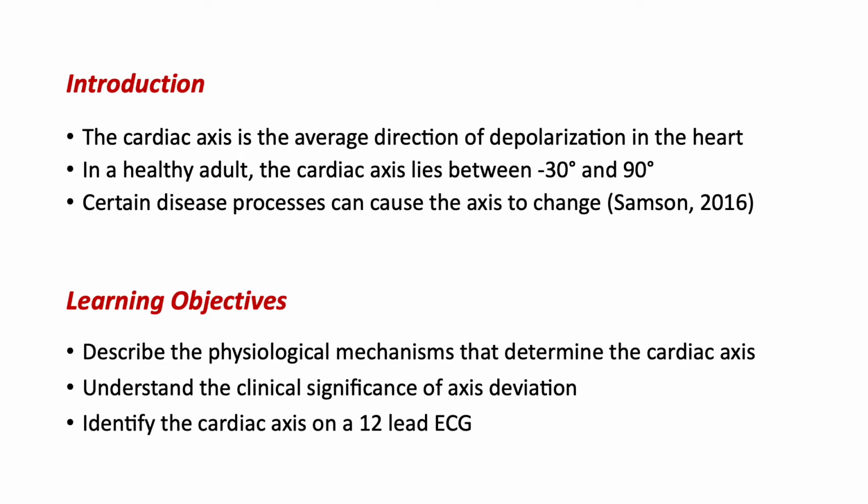But what you need to know is that certain disease processes can cause the axis to shift outside of these values, and that's why it's really important to know about cardiac axis. So today we'll be discussing the physiology of cardiac axis. We'll talk about some things that might cause the axis to be abnormal, and we'll have a practice at identifying the cardiac axis on some ECGs.